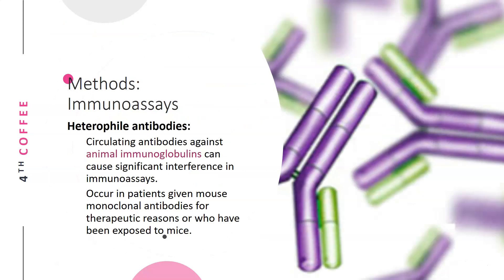Heterophile antibodies are circulating antibodies against animal immunoglobulins and can cause significant interference in immunoassays. They occur in patients who have been given mouse monoclonal antibodies for therapeutic reasons or who have been exposed to mice.